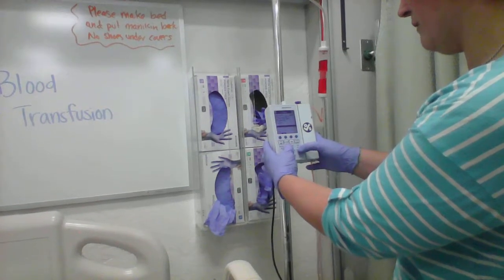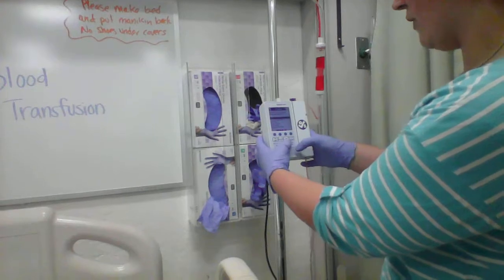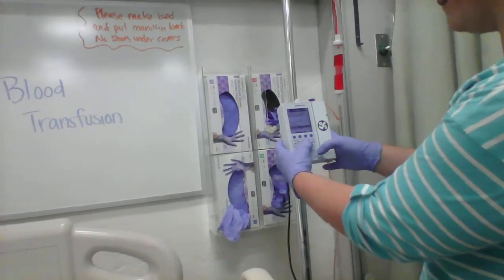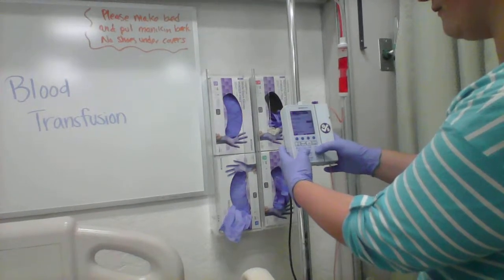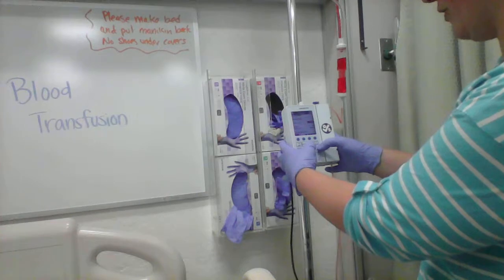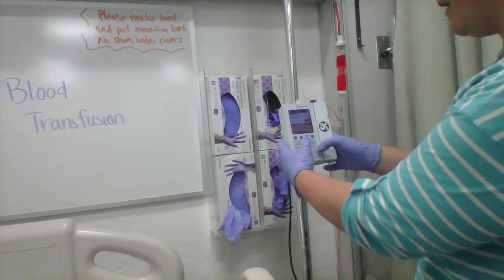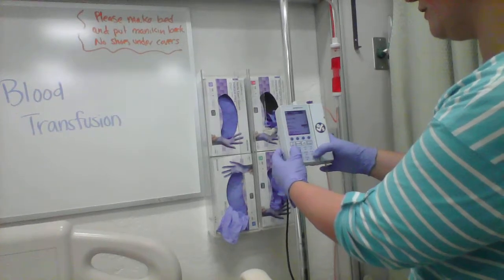We're giving blood. So you signed the consent form, correct? So we have your permission to proceed. We're giving packed red blood cells. And this is the primary bag. And we're infusing to start out at a rate of 120 mils per hour. And the volume to be infused is 300 milliliters.